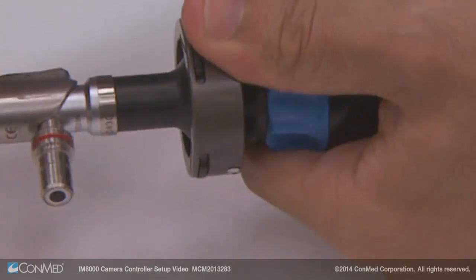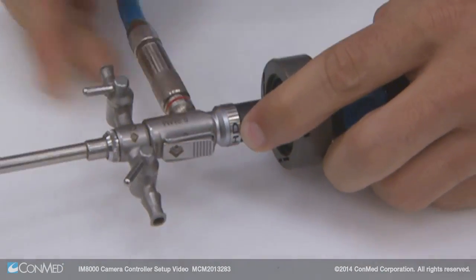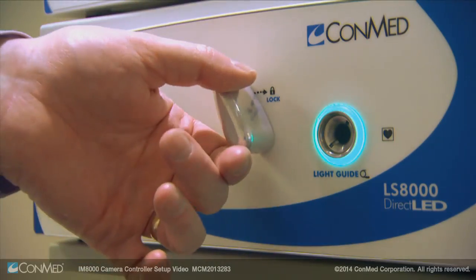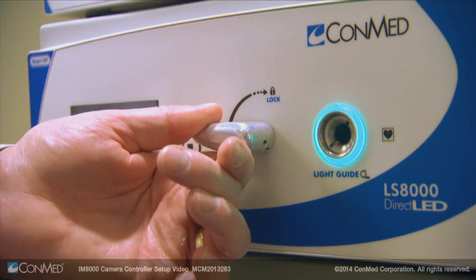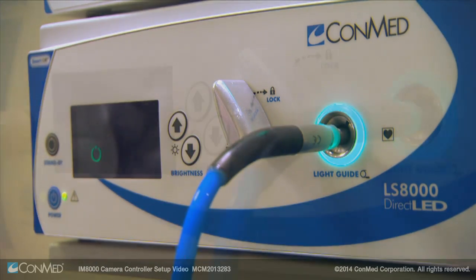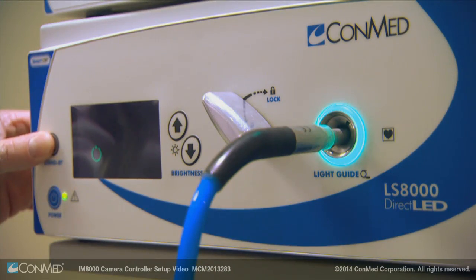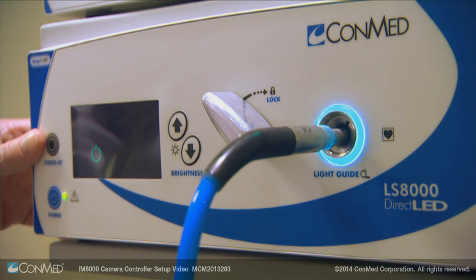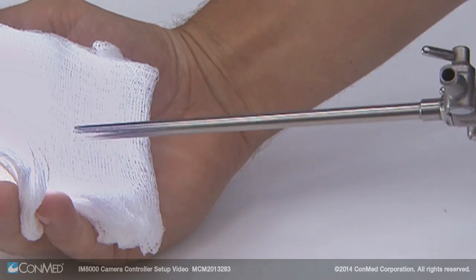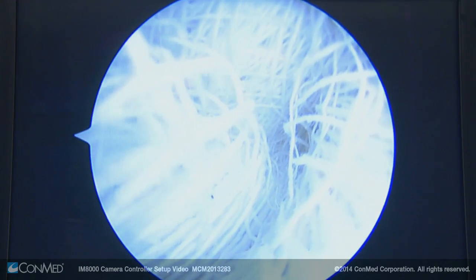Attach a scope to the camera head by pushing the rabbit ears together and connect the light guide. On the LS8000 direct LED light source, push the lever to the unlocked position to insert the other end of the light guide. A blue ring will appear. If it is not inserted all the way, the unit will flash when you go off standby mode. Properly white balance the camera and confirm the white balance OK message on the screen.